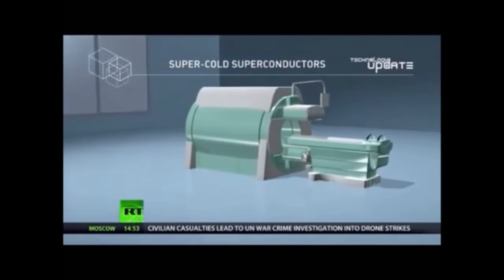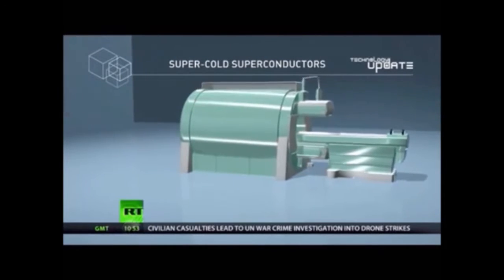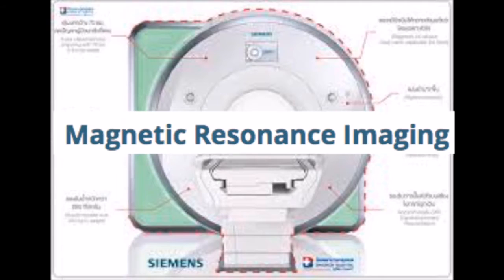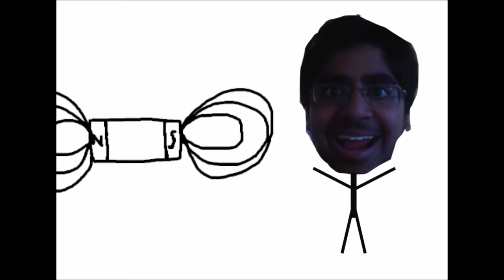the human body. These signals, however, are sensed by a radio antenna, and are then processed by a computer to capture images of inside a human body. MRI stands for magnetic resonance imaging, so it uses magnets and makes pictures. Clearly we're off to a great start.